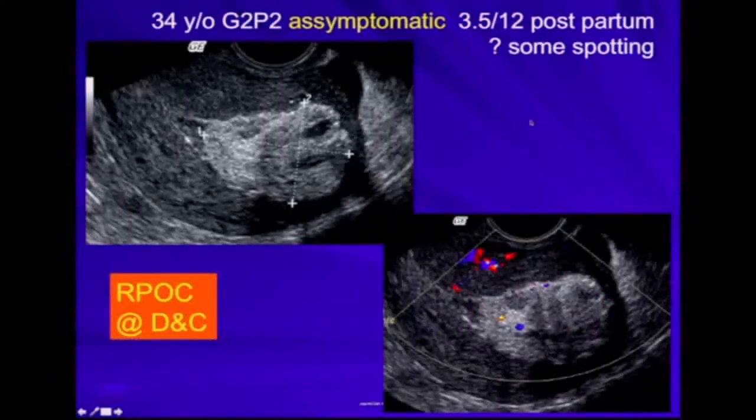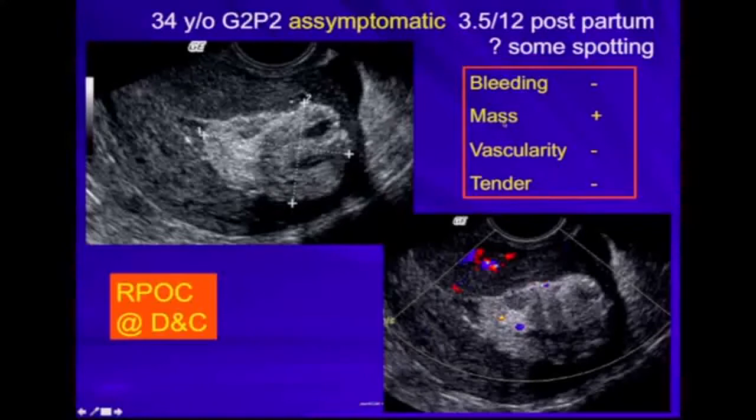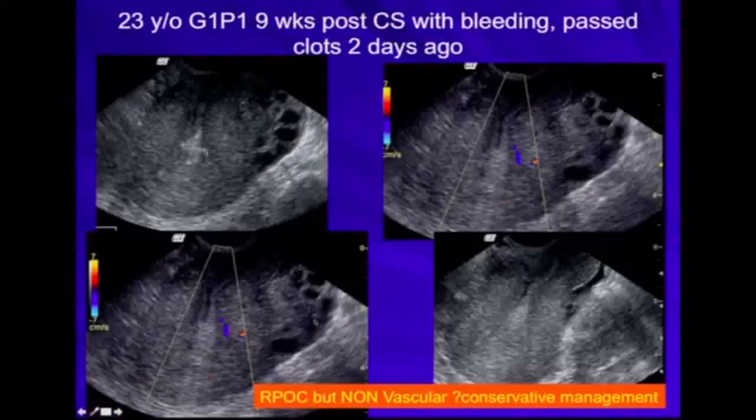This is a very interesting patient. She was absolutely asymptomatic 3.5 months postpartum. Maybe she had a little bit of spotting, or else she wouldn't have come to ultrasound. We saw this large echogenic mass with no increased vascularity, situated right in the endometrial canal. When I called the doctor and I said, there's something going on in there, she was absolutely amazed. She said, are you sure? Because this woman is absolutely asymptomatic. No, I said, there's definitely tissue there. She said, well, okay. They did a D&C, and there was retained products. Most unusual in a woman with very, very little symptoms for such a large mass lesion. She had the mass, but really very little bleeding, not a lot of increased vascularity, and non-tender, but she did have retained products.